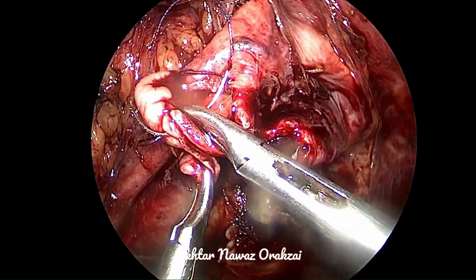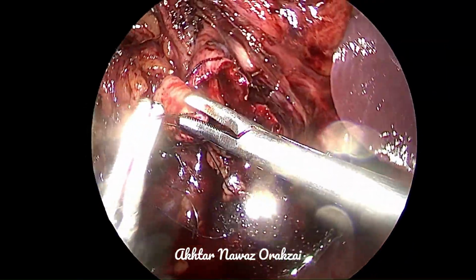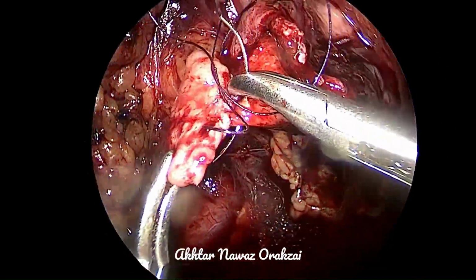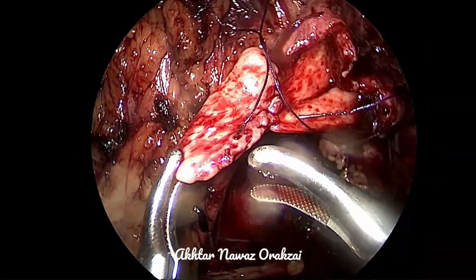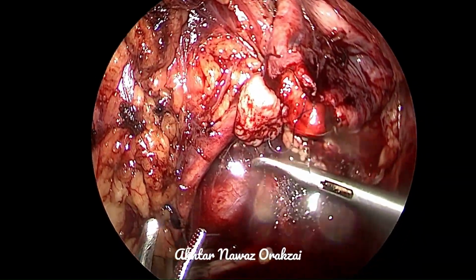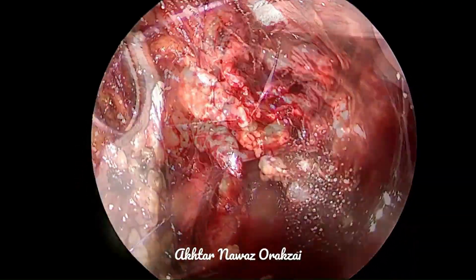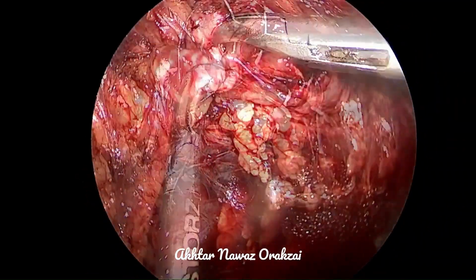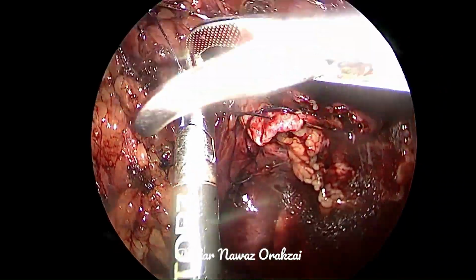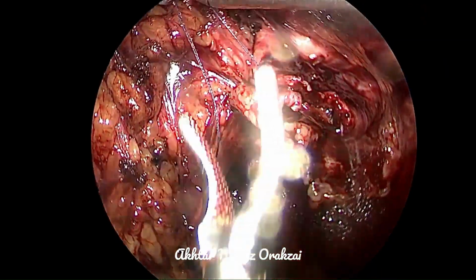As we all know, there is a reflux of urine when the DJ stent is placed, so we need to catheterize the patient for that initial period so that free drainage is achieved. The DJ stent is usually removed 4 to 6 weeks after the reconstructive procedure. However, the catheter can be removed after 72 hours.